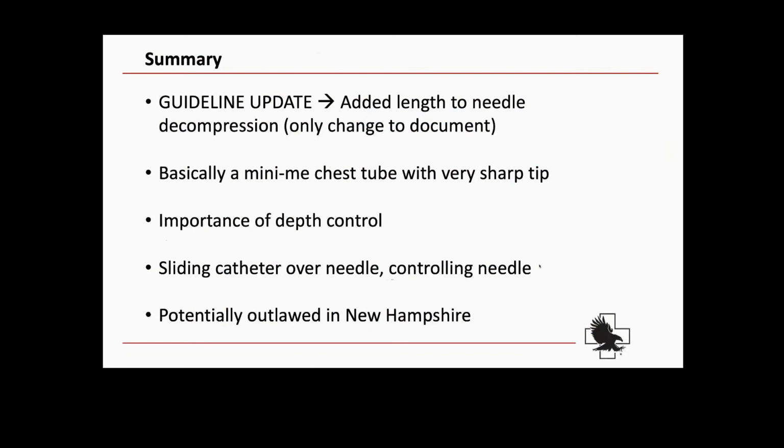It has a very sharp tip, and that sharp tip can lead to lacerations of lung tissue if it is inserted too deeply, or even damage to other structures such as cardiac structures and/or great vessels. So we want to be very cognizant when we're practicing and going through our competencies and invasive skills moving forward, that we're getting used to this device and getting used to using it under the pressures of a scene call.